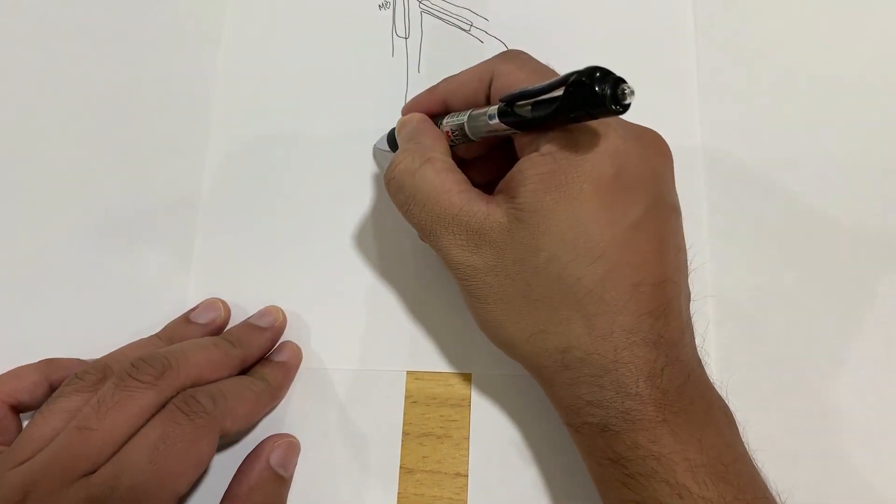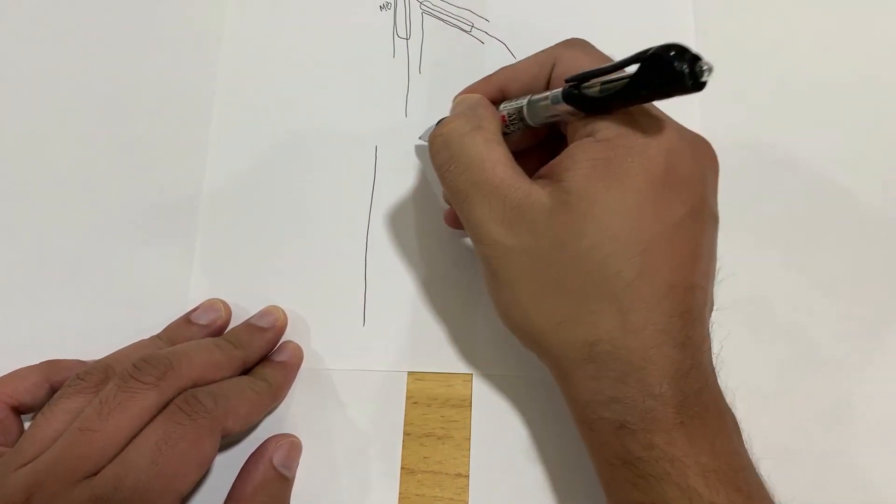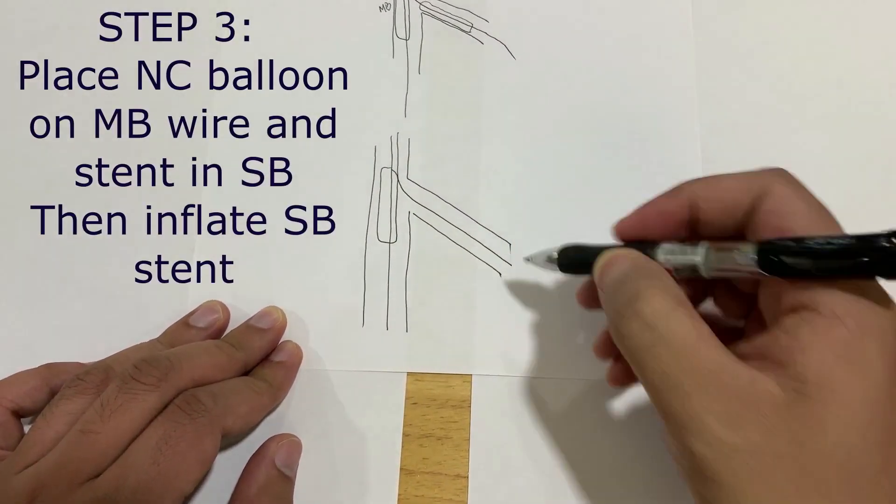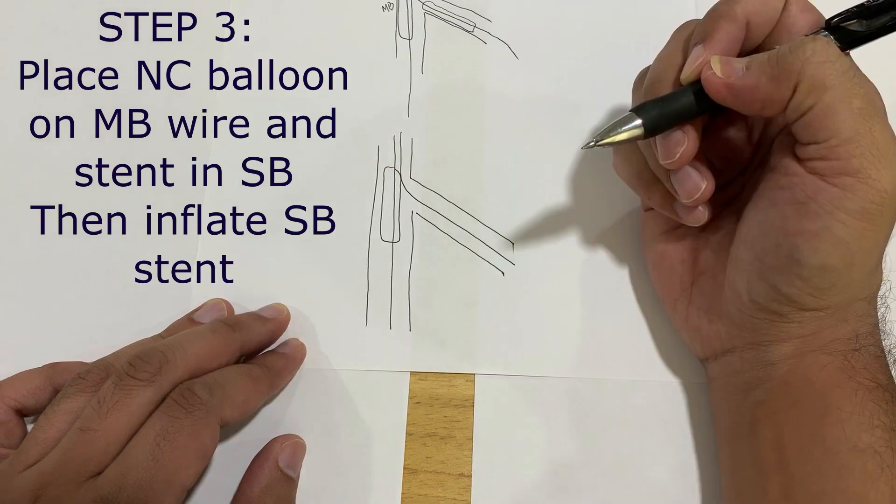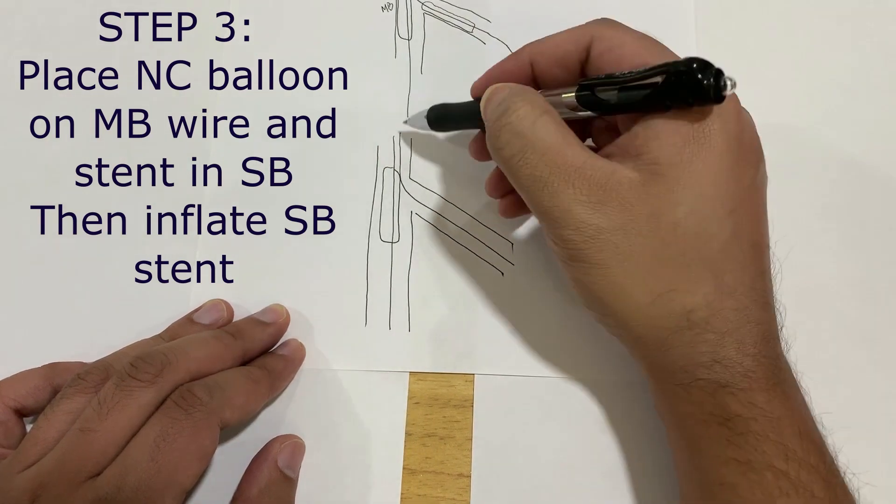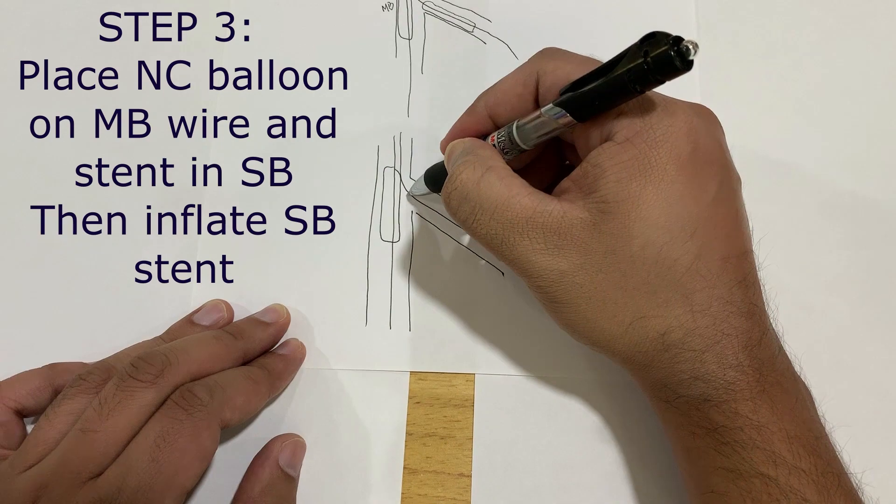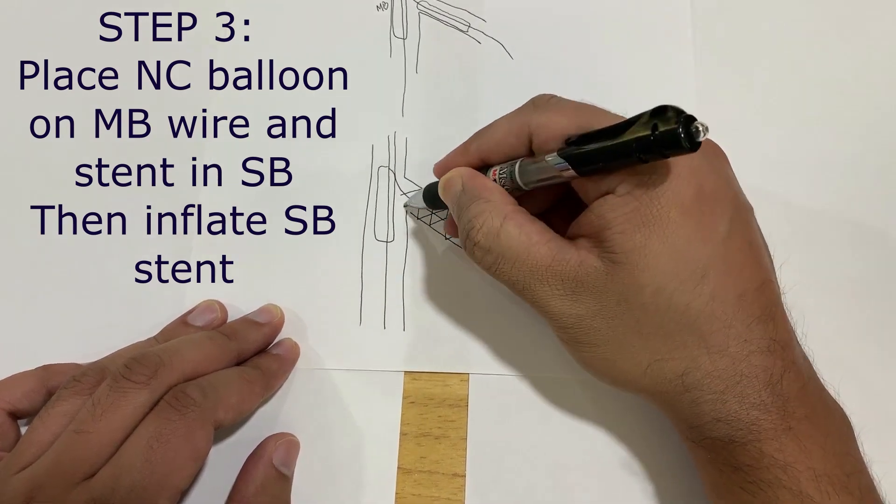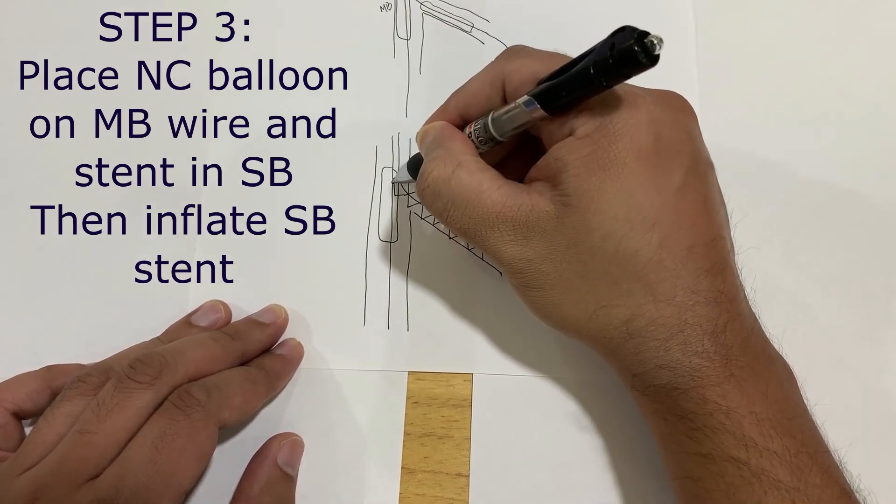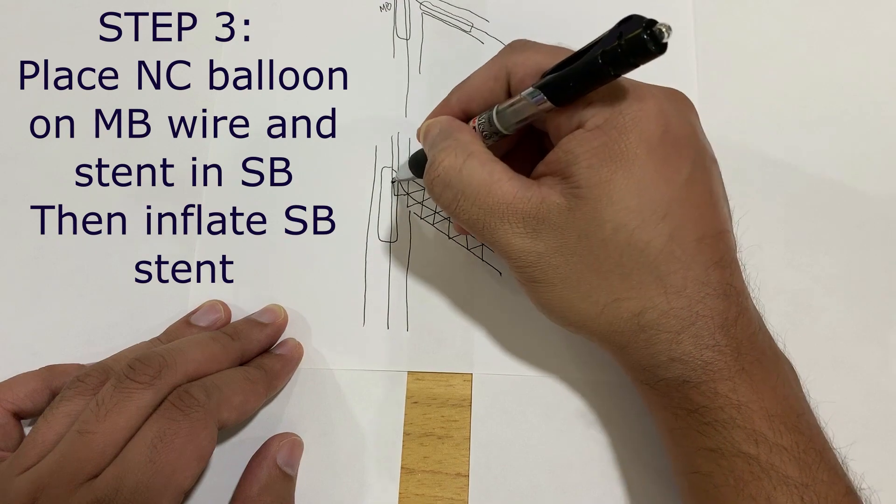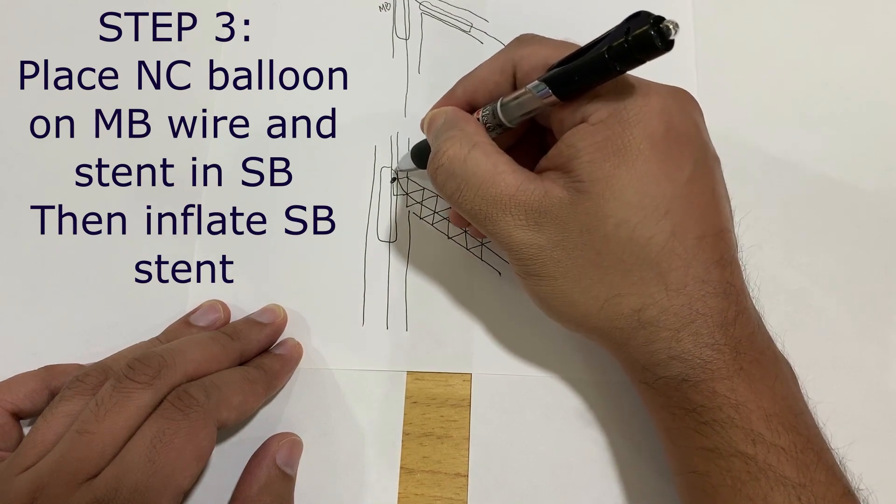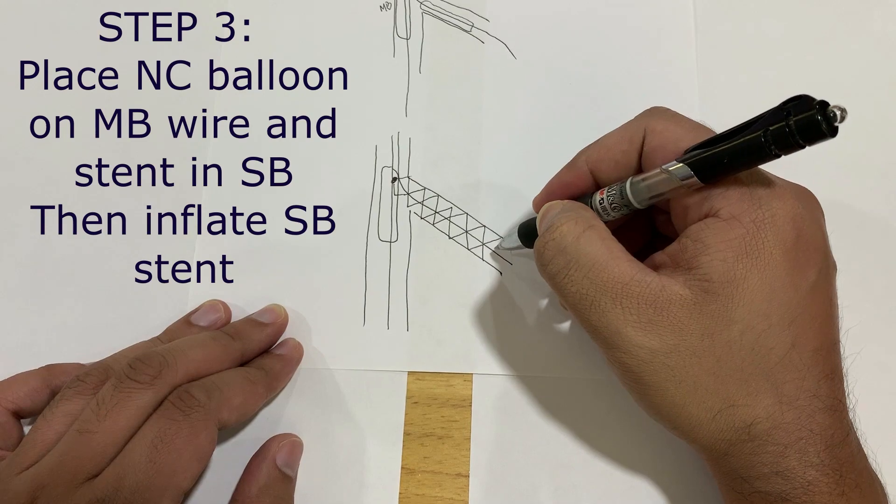After this step, remove the side branch balloon. Once the balloon is removed, you can bring a stent on this wire. Have the proximal marker hanging about two to three millimeter inside the main vessel.